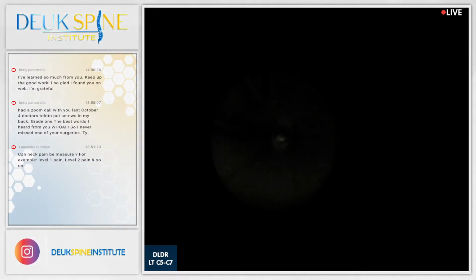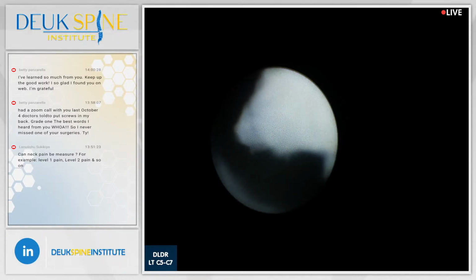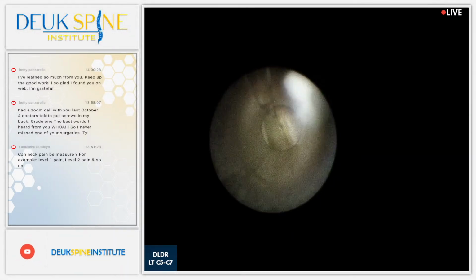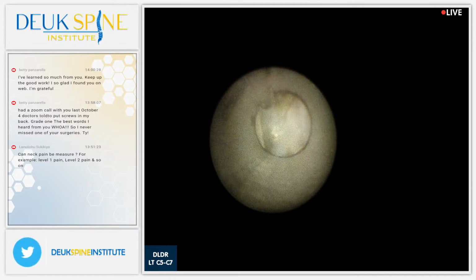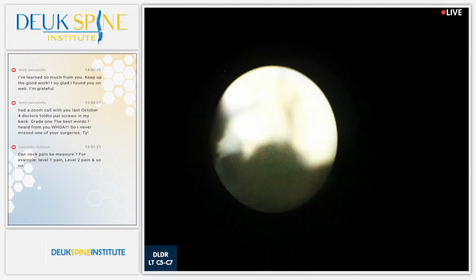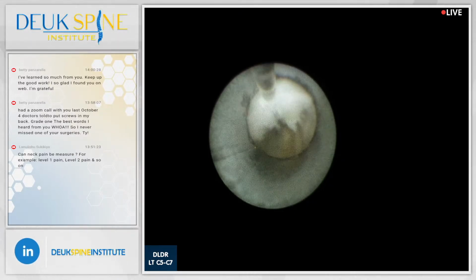Let's go. How much time do we have? I mean, minutes here. I don't know what to tell you. They keep getting these stupid little pieces of herniation. These are garbage. They're not even a real herniation. It's just calcified end plate cartilage. It doesn't do anything but get in my way. Come on. And these things are dense because they're calcified, so they have weight, and they just want to sink back down to the bottom and block my view.